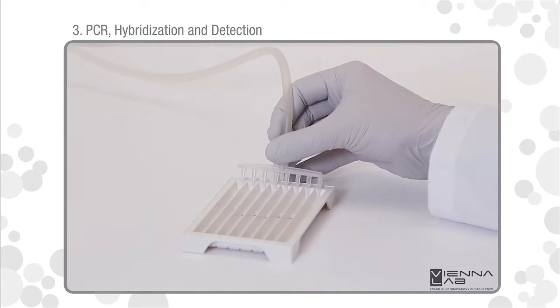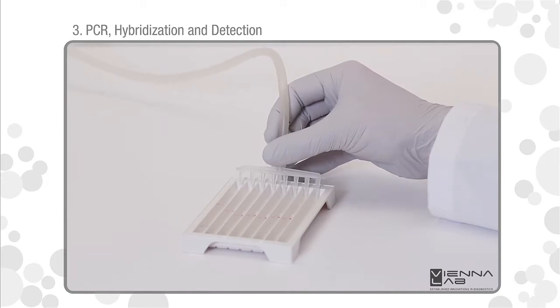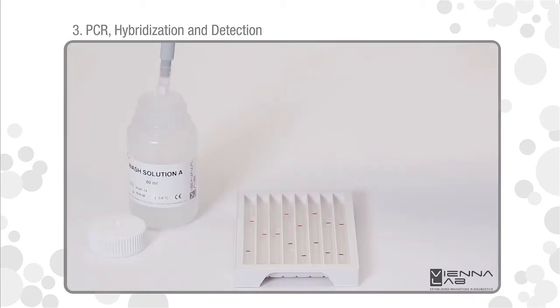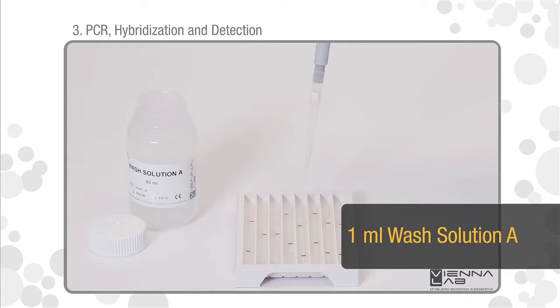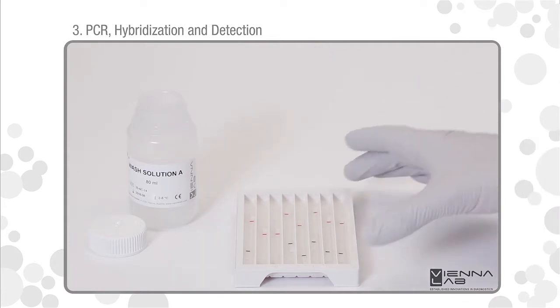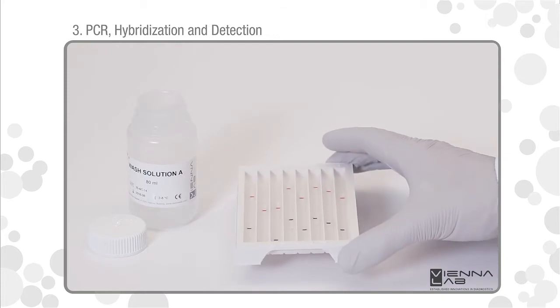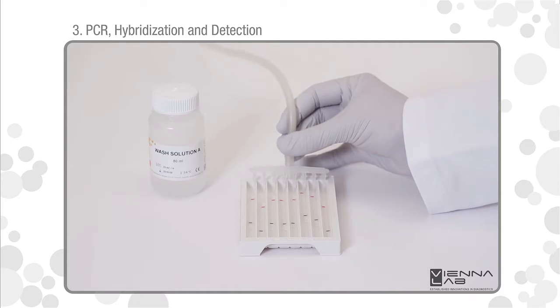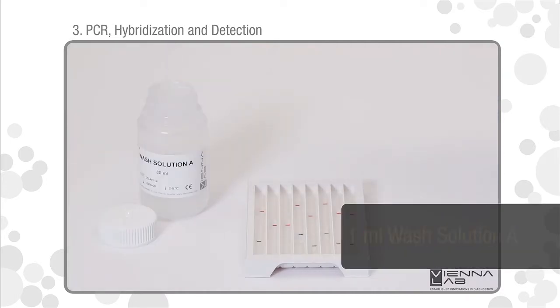At the end of incubation, remove hybridization solution by vacuum aspiration. Proceed immediately. Do not allow test strips to run dry during the entire procedure. Add one milliliter wash solution A pre-warmed to 45 degrees Celsius. Remove liquids by vacuum aspiration. Add one milliliter wash solution A.